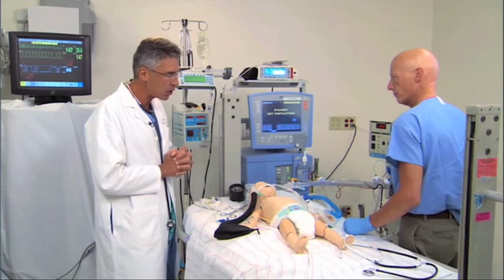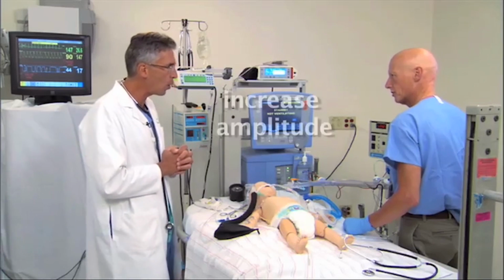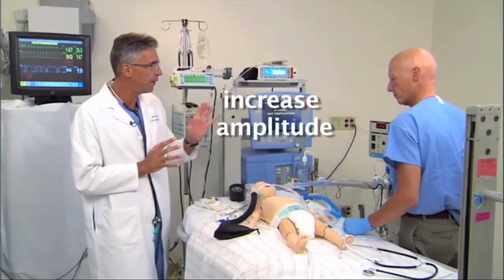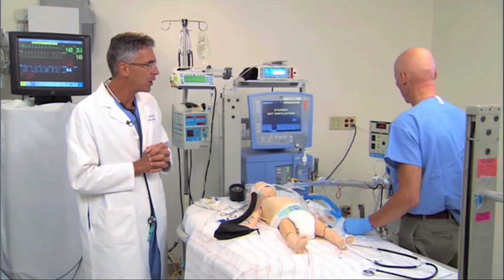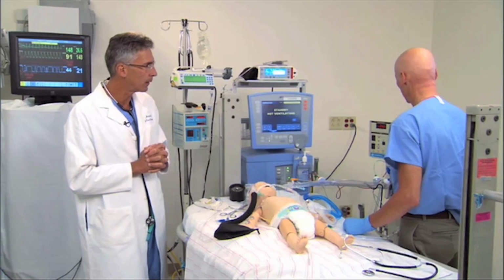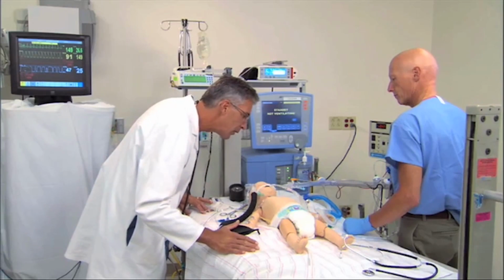Now, Barry, I'm not sure we're moving that chest very well. I agree, John. Why don't you go up on the amplitude? We're at 53 centimeters delta pressure now. I think 60 might be a good target, Barry. And now I'm beginning to see some chest wiggle.